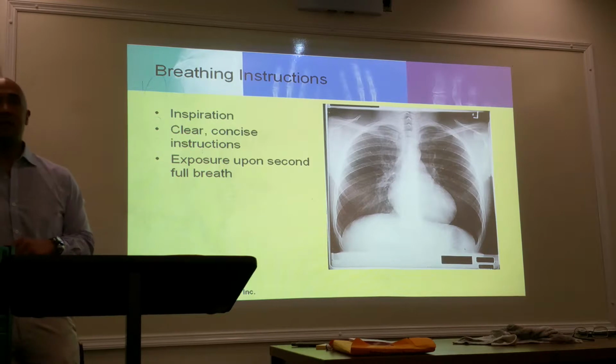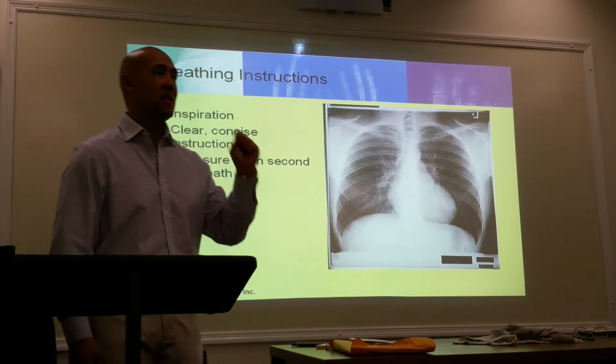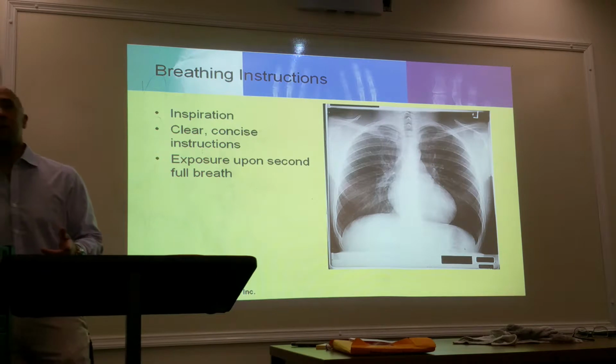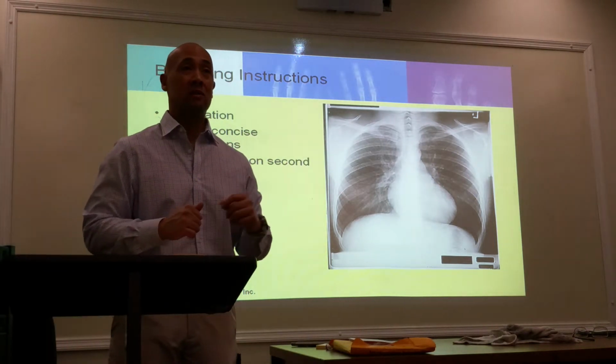Breathing instructions. Exposure is done on inspiration. We do it twice. Take a deep breath in, blow it out, take one more deep breath in, and hold it. Hold it, hold it, hold it. And you're watching them, right? That's why we got windows.